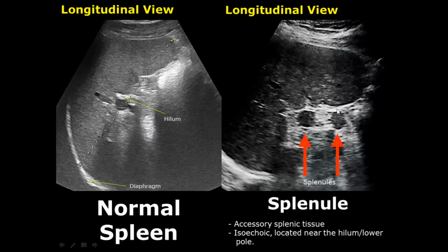Here you can see two separate splenules. They can be more than one in some cases.